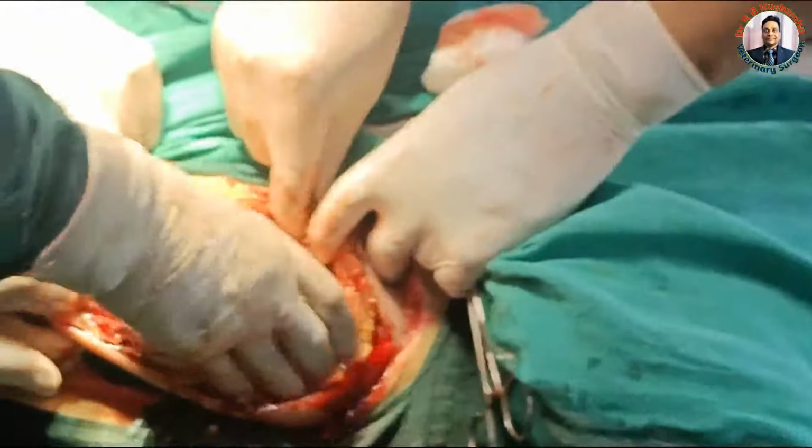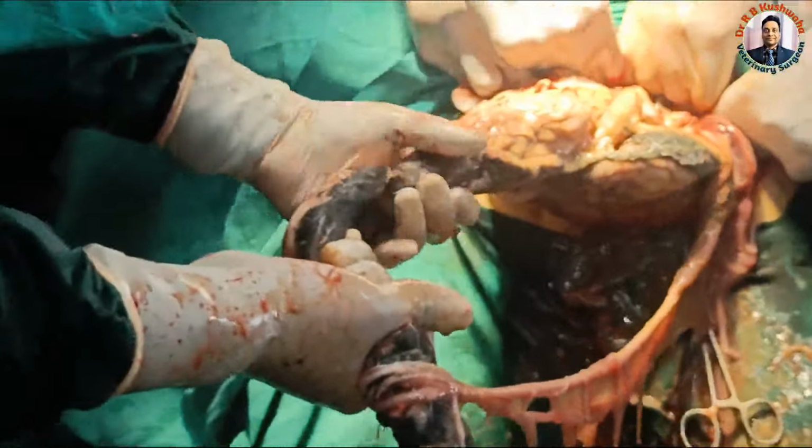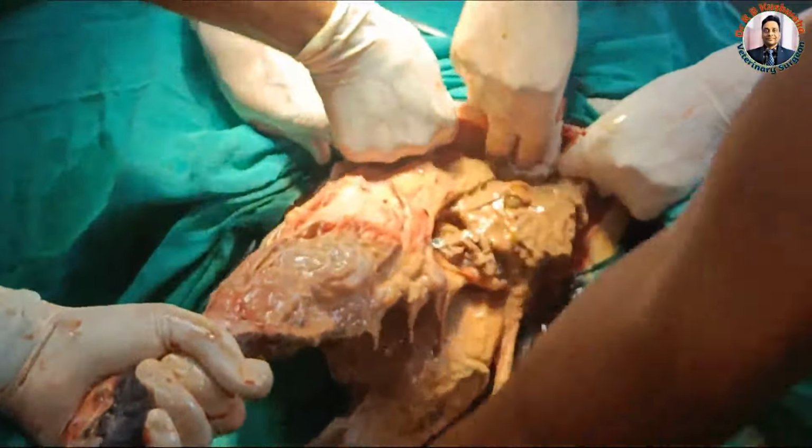You people did not take the history properly. Just catch hold of the uterus. Just keep on focusing on holding the uterus.